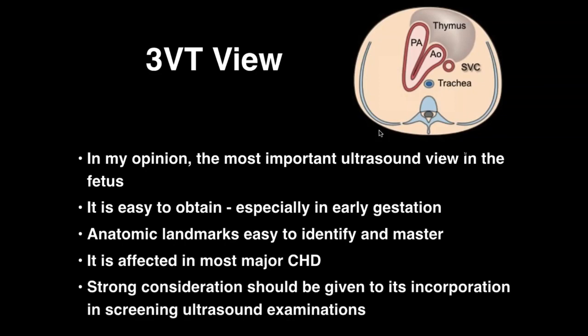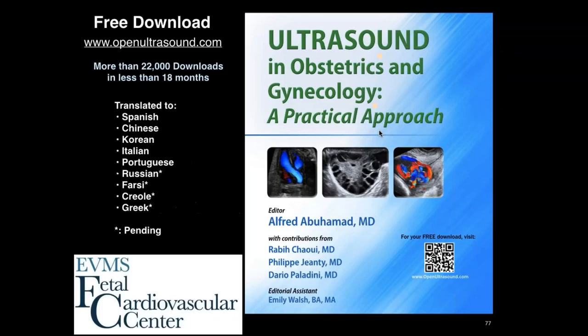And it should be given strong consideration, I'm hoping, for incorporating this in the screening examination, and I'm hoping to be an effective advocate for this view to really enhance our ability to look at the heart and also to diagnose more conotruncal anomalies than we have done in the past.